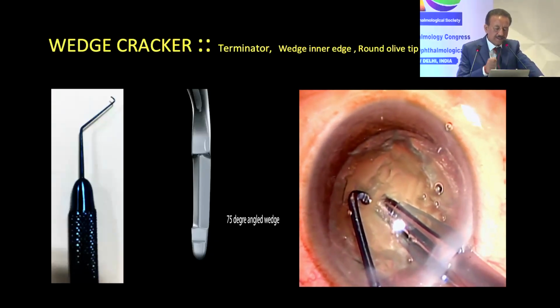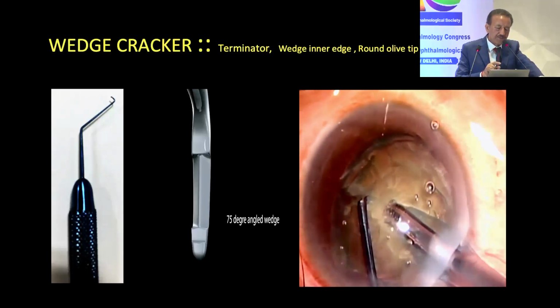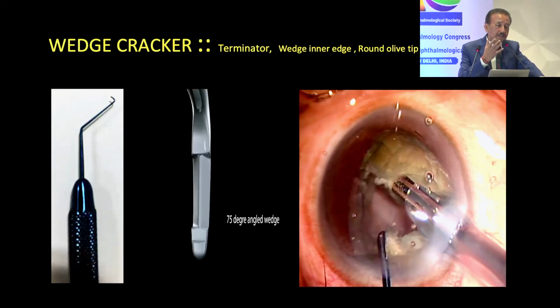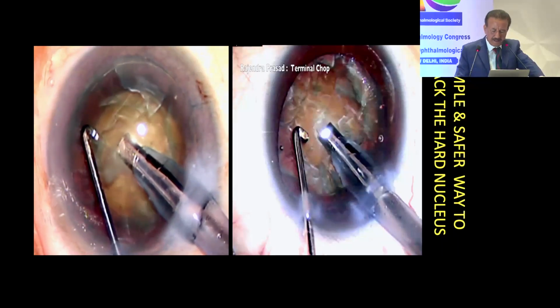When you use this wedge cracker, just hold the nucleus at the center, and you have to go around the nucleus, and when you bring it around you see the crack has already happened. You don't have to bring it to the center of the nucleus and don't have to cut the nucleus. You are just cracking the nucleus at the equator, and this crack, which happens at the equator, transverses to the center, and you get a complete splitting of the nucleus. Like if you have a glass block, if you crack it from the equator, you get a complete cracking. This is what happens with this cracker.